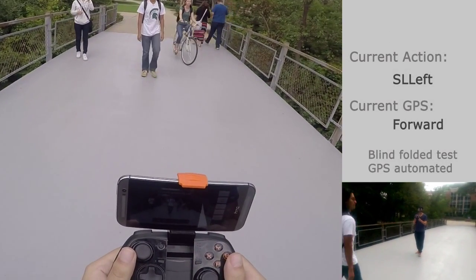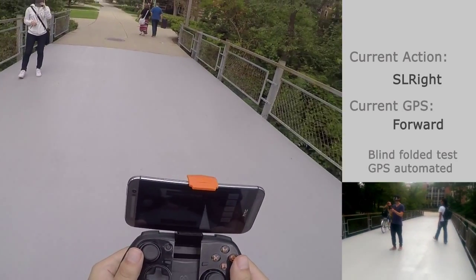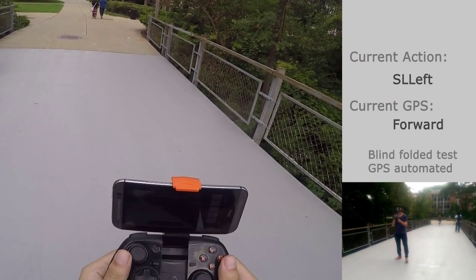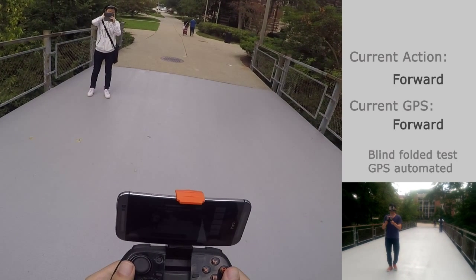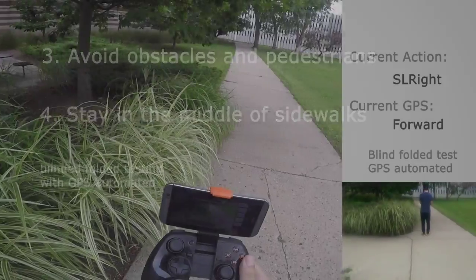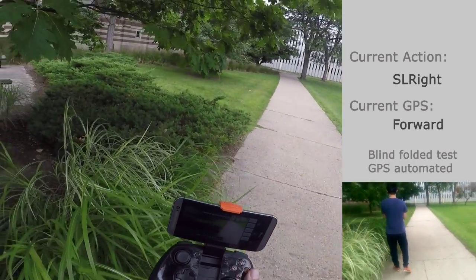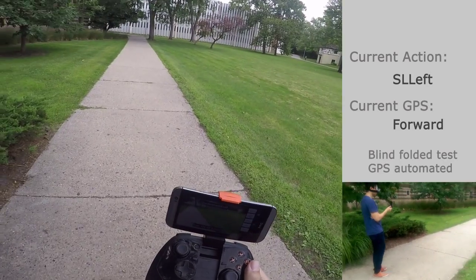The network asks me to turn slightly right when it sees a pedestrian in front of me. The network reminds me to turn slightly right when it sees bushes protruding into the sidewalk. It also reminds me to turn slightly left to return to the middle of the road.